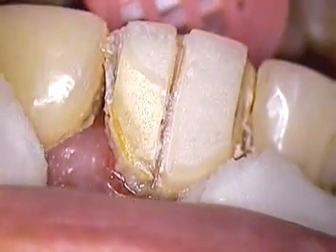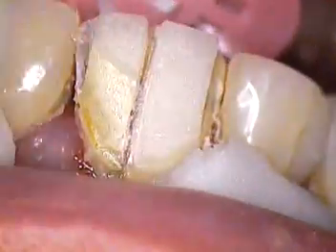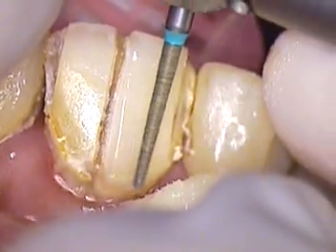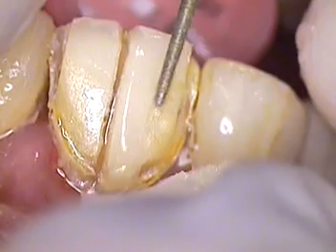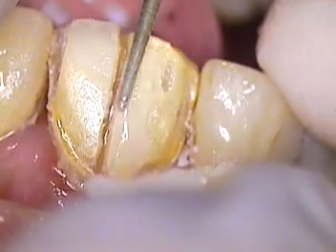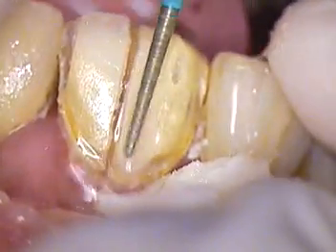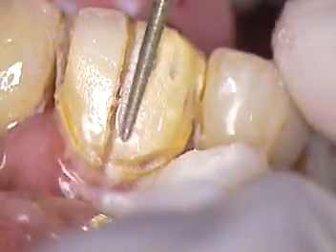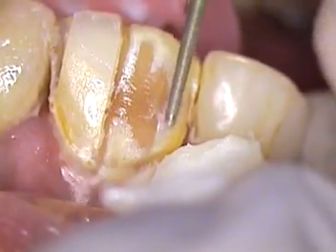Yeah. So it's a little too difficult to remove just by trying to separate. So we'll prepare it in sequence. What I'm doing is going to a depth of 0.75 with this burr, and I'm trying to go between 0.7 and 0.9 on the full labial contour. Again, we're going to bring it back a little bit if we can. If we want to stay on enamel, that's important. So this initial prep design is key, and getting enough room for the ceramic to mask out this very deep and dark stain that's apparent.